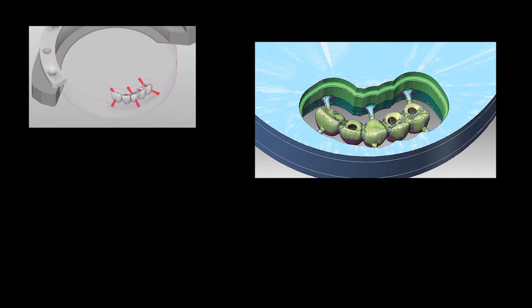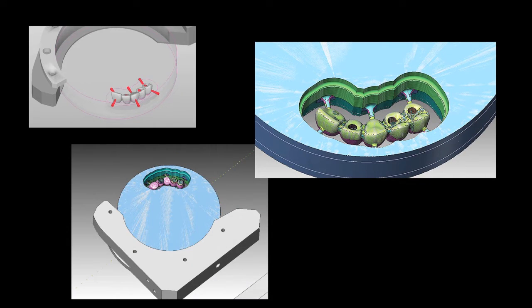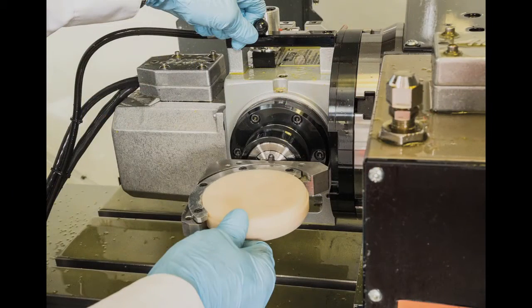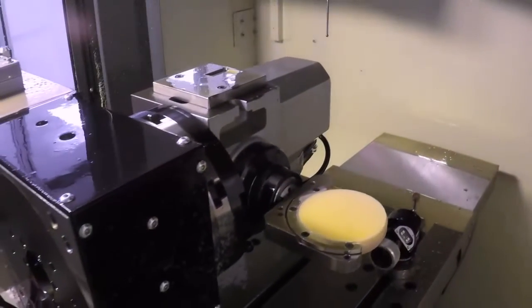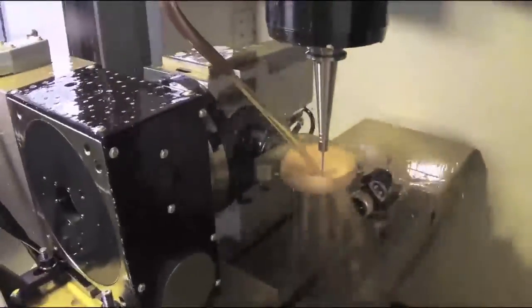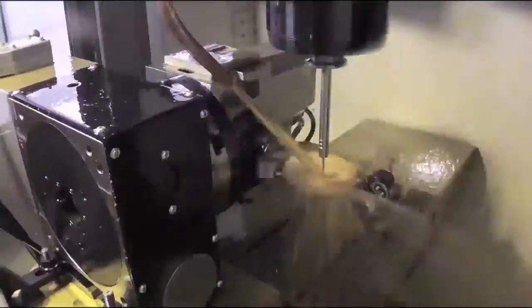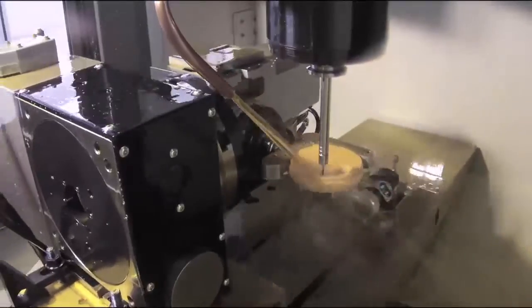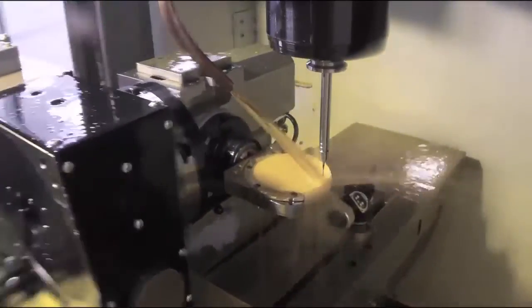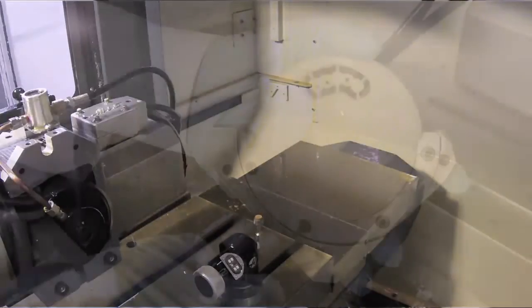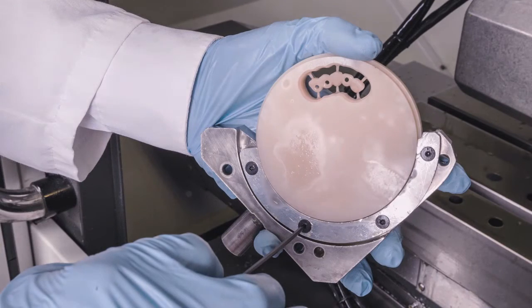Once we confirm the prosthetic design on the virtual model, CAM files are generated and then sent to the milling center for fabrication of the screw-retained temporary. A layered PMMA disk is inserted into the fixture and the temporary restoration is milled, creating an exact physical duplicate of the CAD design.